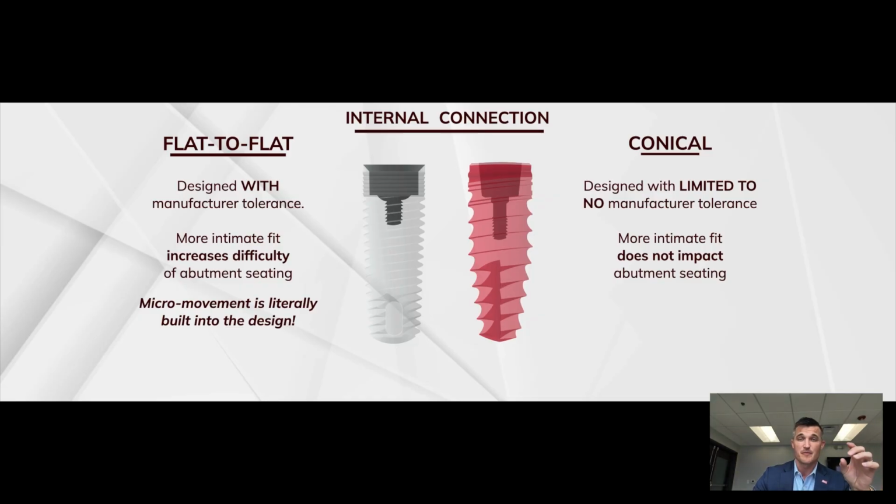The more intimate the fit, the harder it's going to be to seat that abutment. So they actually have to have a little bit of wiggle room there so that you can seat that abutment. So this micro motion is built into the design of the implant.